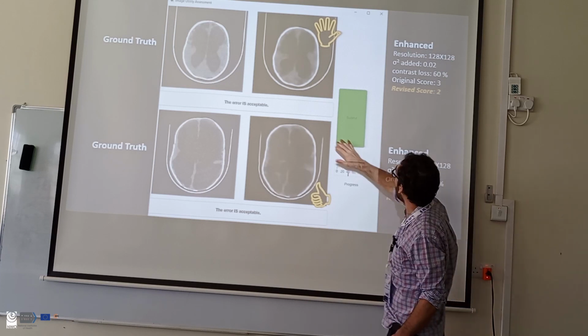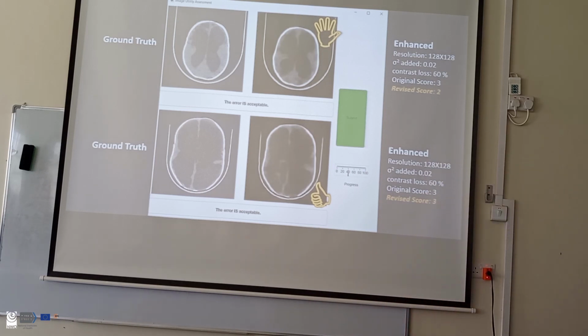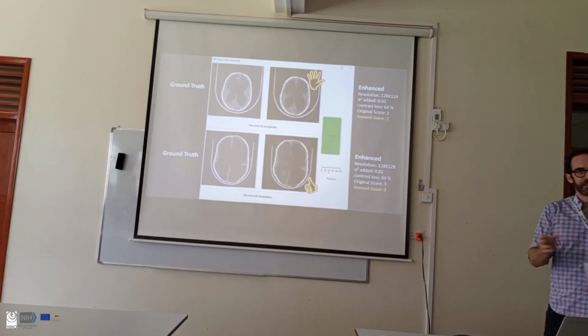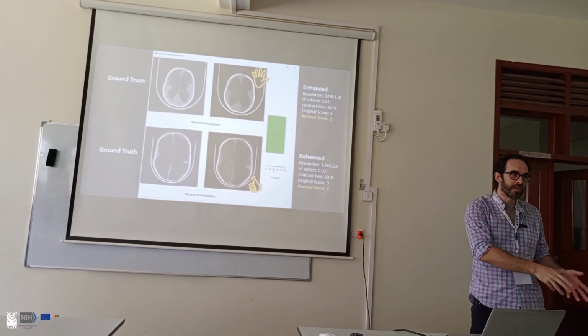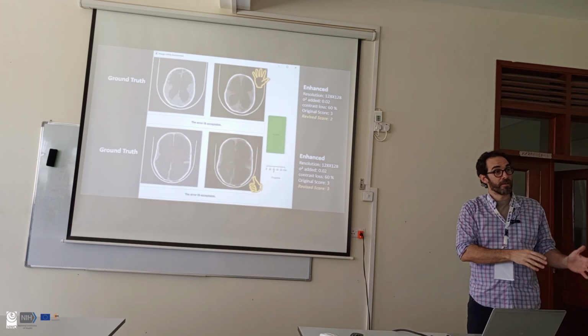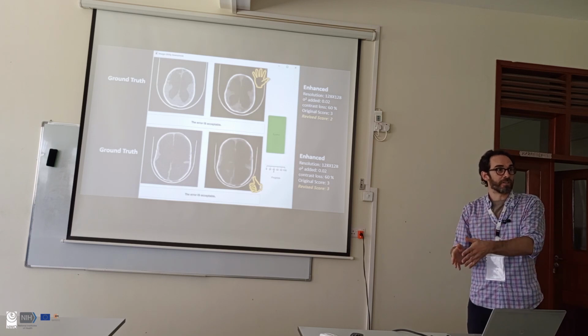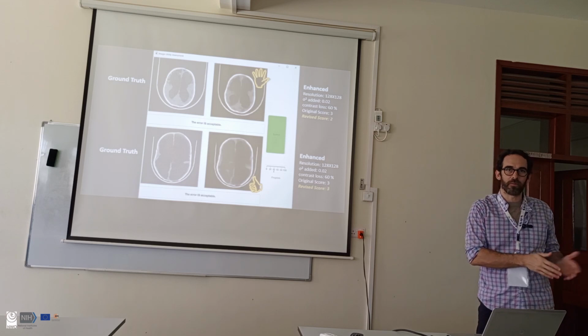These actually had the same amount of contrast loss and the same amount of noise in the degraded version. So what I see from this qualitatively, and we'll go to the quantitative stuff in just a second, is that you can't necessarily depend on the amount of contrast or noise in the image for the enhancement part. The biology, the physiology that's present in the image also matters in terms of the quality of the output of the machine.